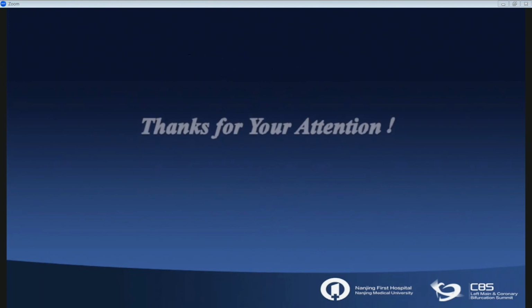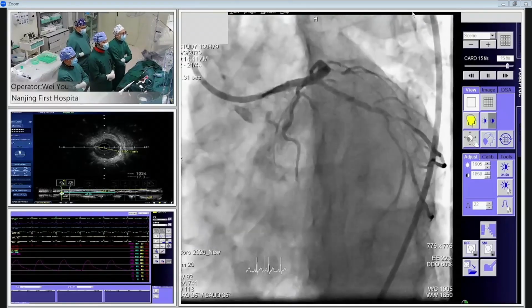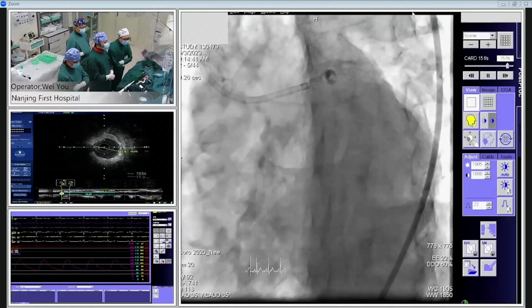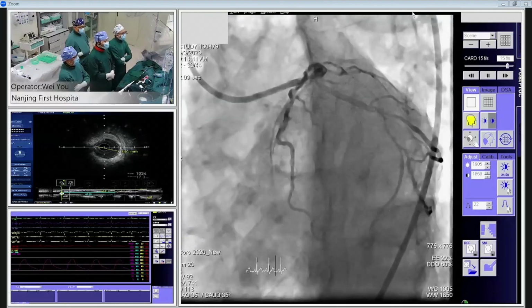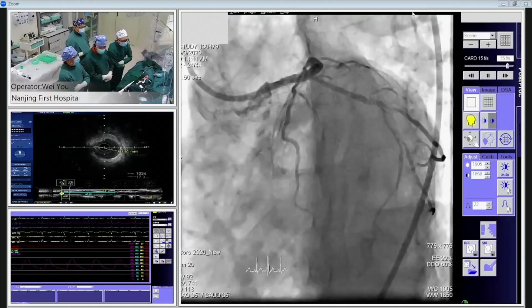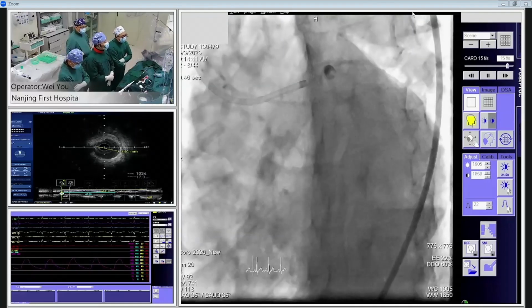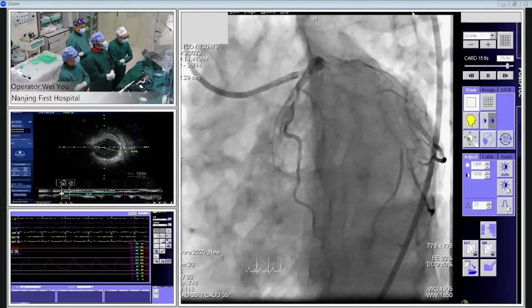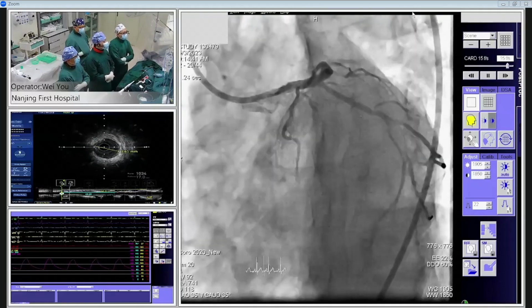Okay, thank you, Dr. Wu. Very brief and clear case introduction. As you can see, the patient is high-risk level patient and with the right dominant, and we have performed the previous PCI and 3 DES to cover the RCA disease. And today, can you see our today's angiographic left coronary artery? You can see very clearly the previous stent in the proximal segment of the circ, and also for the distal circ with the first obtuse marginal is also a Medina 0112 bifurcation lesion.